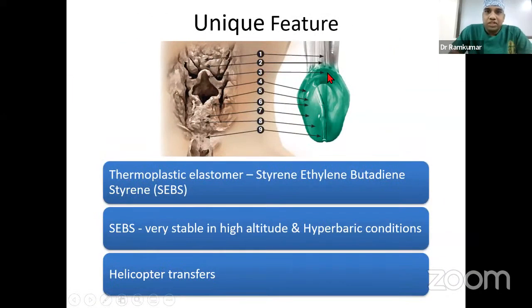The important feature is this mask, this cuff, which is made up of a thermoplastic elastomer. The chemical name is styrene ethylene butadiene styrene. It is not uniform in shape. It has some elevations, depressions and notches, which are exactly the mirror image of the periglottic structures. So it fits very well as it is inserted and warms to body temperature. It adapts to the periglottic structures very well. So it gives very good ventilation, and the oropharyngeal leak pressure is very high.